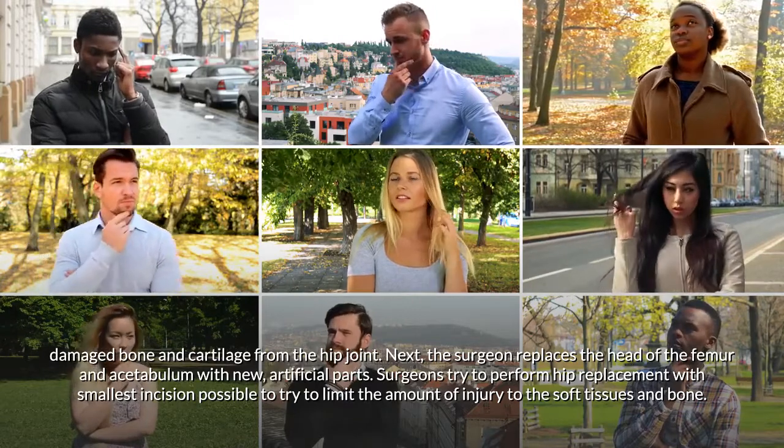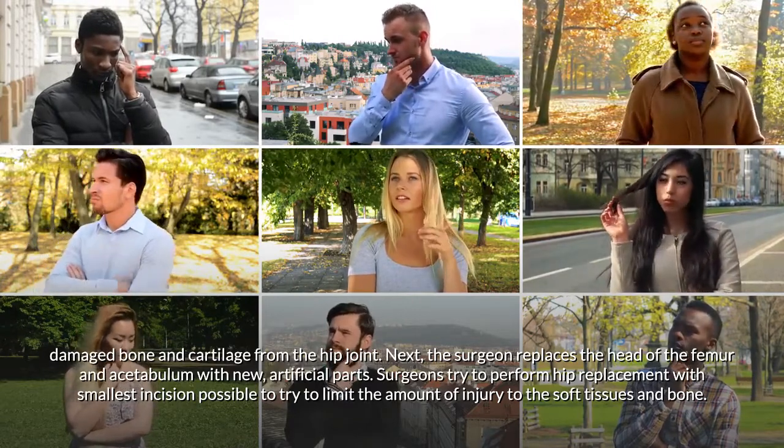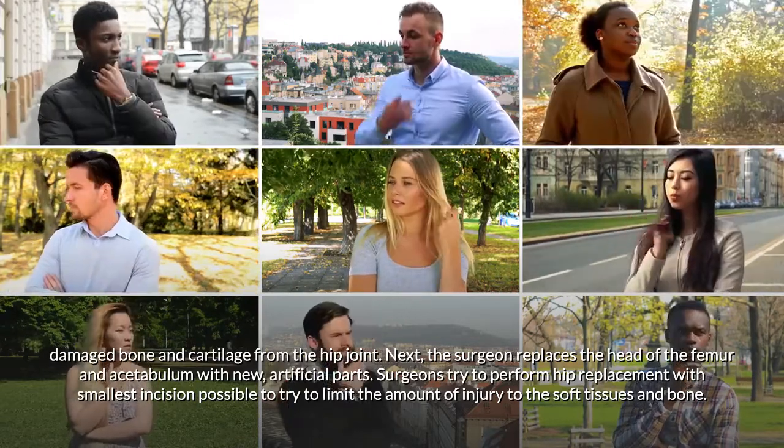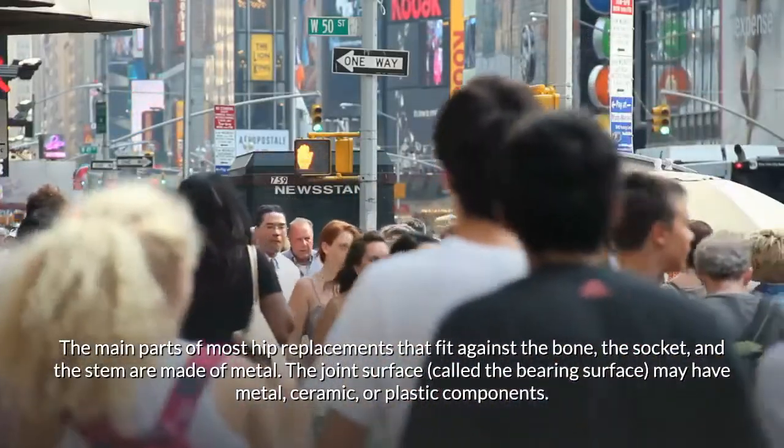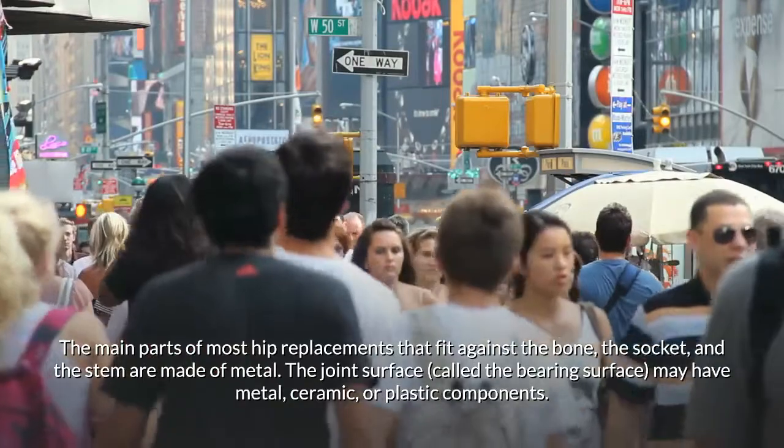Surgeons try to perform hip replacement with the smallest incision possible to limit injury to the soft tissues and bone. The main parts of most hip replacements that fit against the bone — the socket and the stem — are made of metal.